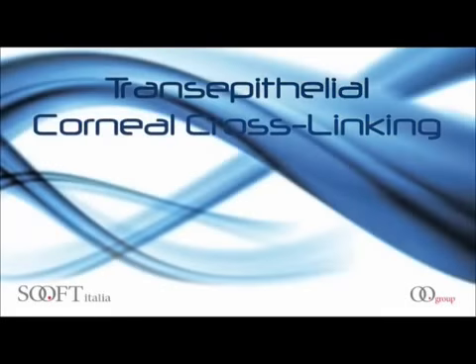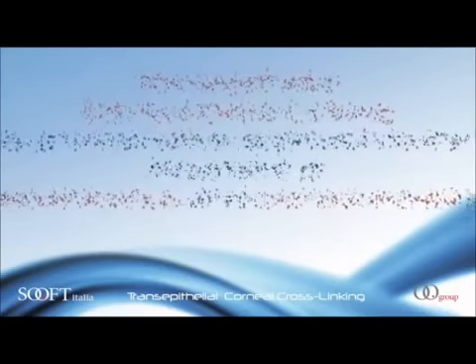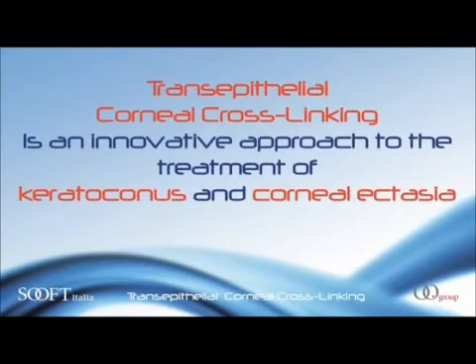Transepithelial corneal cross-linking. Transepithelial corneal cross-linking is an innovative technique for the treatment of keratoconus and corneal ectasia.